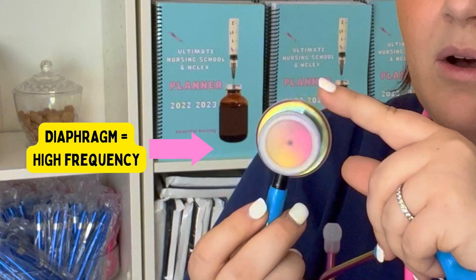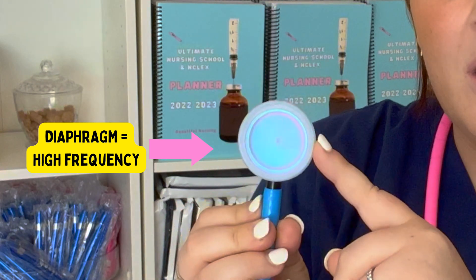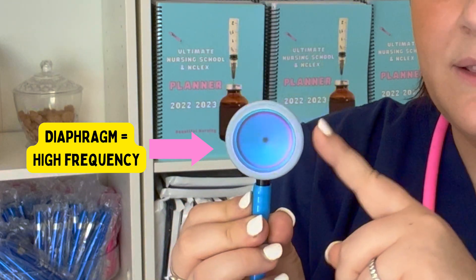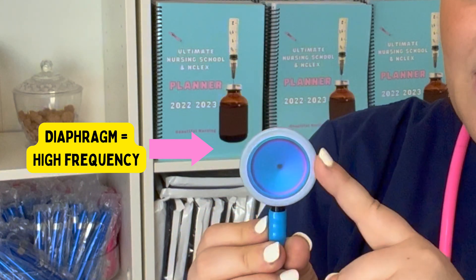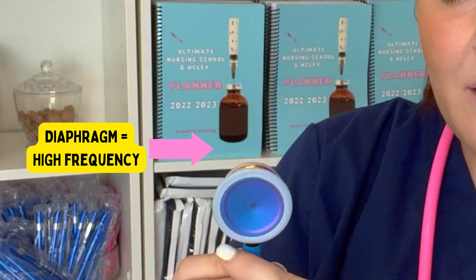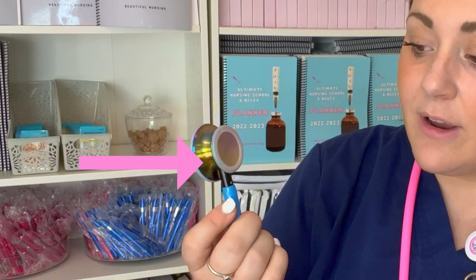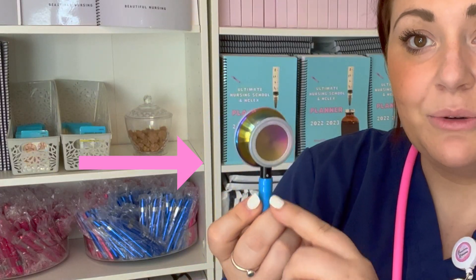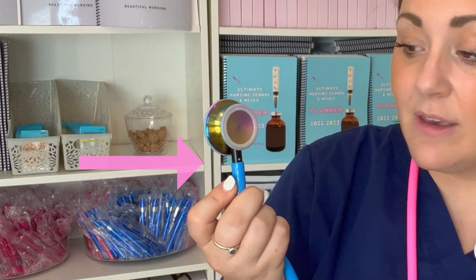We also have a larger, bigger diameter which is called the diaphragm. The diaphragm is usually used for the lungs and the heart because it hears a higher frequency. So it's bigger, higher frequency — called the diaphragm. The nice thing about these stethoscopes in your new kit is that there is a dot to remind you which side your stethoscope is going to be hearing the frequency on.